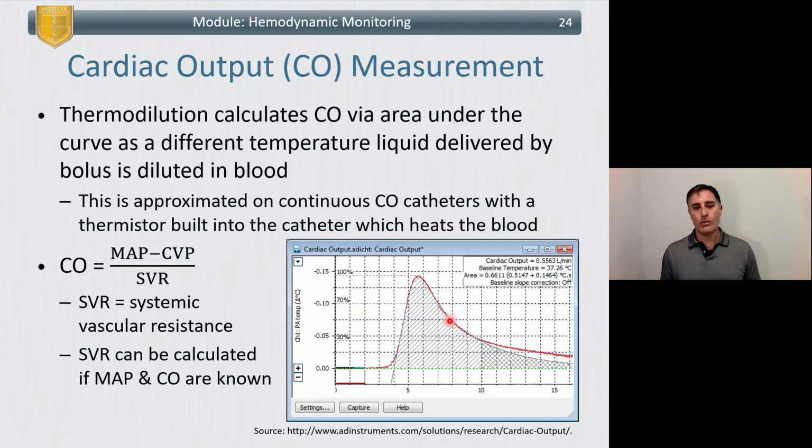A lot of the newer pulmonary artery catheters, certainly the ones that I use within our cardiac ICU all the time, actually have a thermistor. It kind of looks like a bronzish kind of tape around the distal portion of the pulmonary catheter. That thermistor actually heats up the blood directly and then rapidly cools down. And in doing so, it essentially is as if you're injecting warm fluid in, and it has the ability to then measure how quickly that warmed up blood hits the distal end, and based on that do a cardiac output calculation.